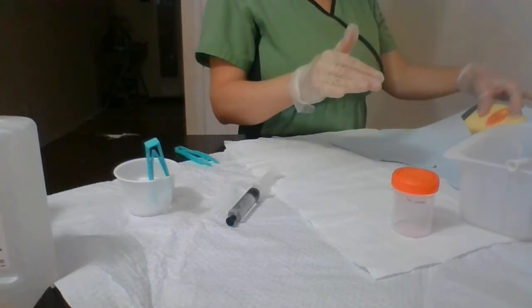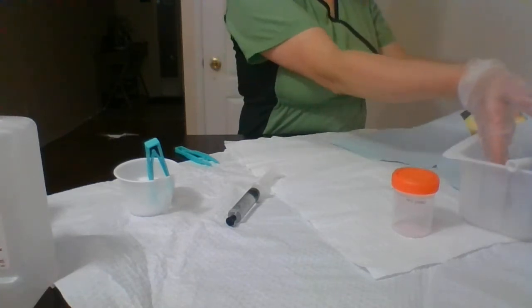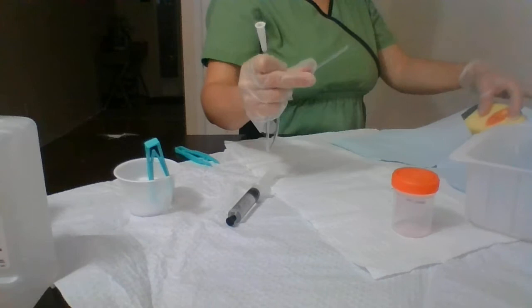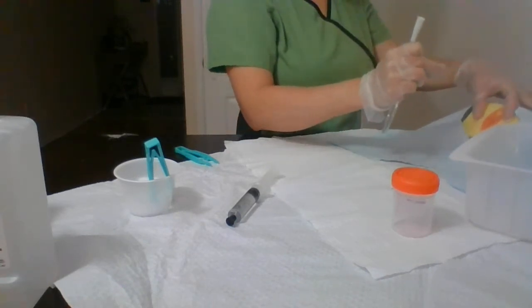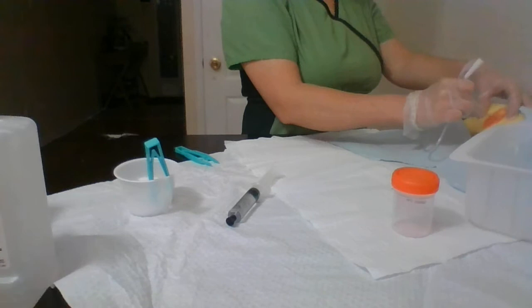Okay, so my catheter is already prepared. I will use my sterile hand. I already have the lubricant on my catheter. So I will insert the catheter 5 to 7 centimeters.